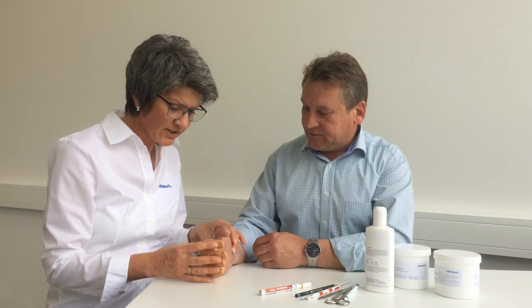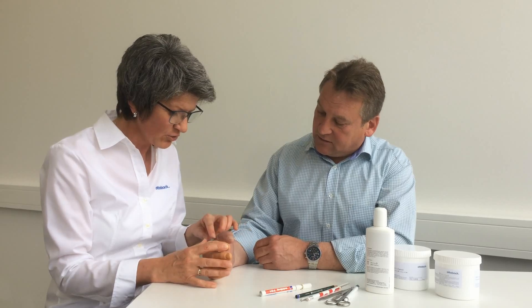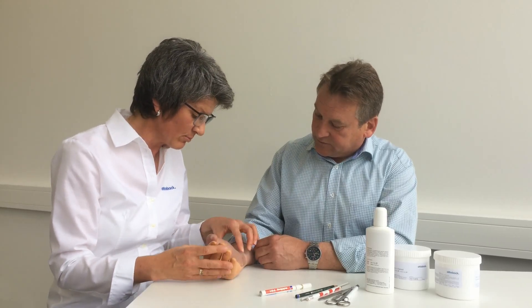In that case, let's change the position of the fingers so that you can use the thumb as a counter support. I'll shorten both the thumb enclosure and the proximal socket brim.